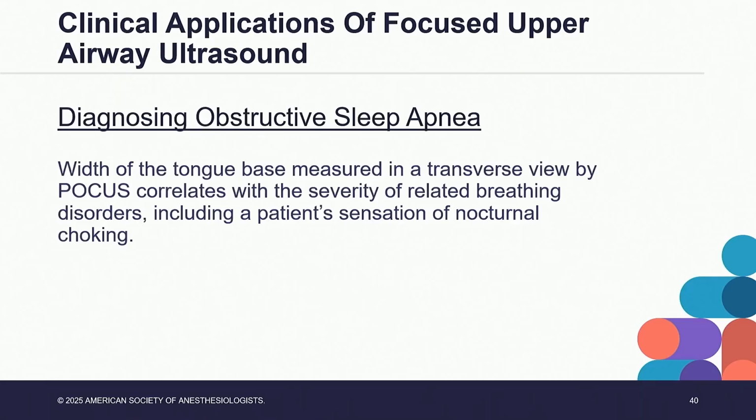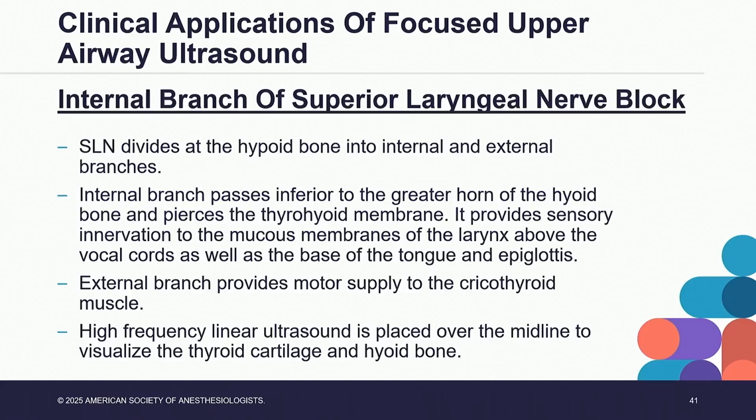Also, POCUS can be used for obstructive sleep apnea, with the width of the tongue base measured in the transverse view by POCUS correlating with the severity of the sleep-related breathing disorder, including a patient's sensation of nocturnal choking. How about the blocks? We can use it also for doing blocks.